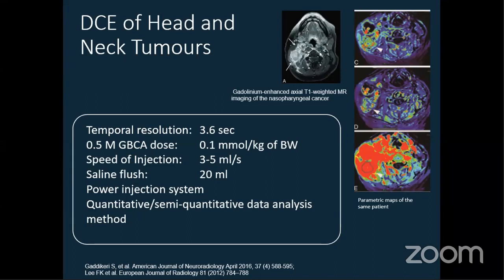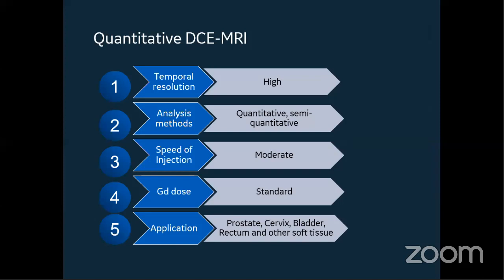But the dynamic contrast enhancement of the neck soft tissues is routinely performed using Clariscan bolus injection by Professor Marco Franconi at Sapienza University Hospital in Rome with a similar protocol as you see in this example. These were just some of the examples of quantitative dynamic contrast examinations.